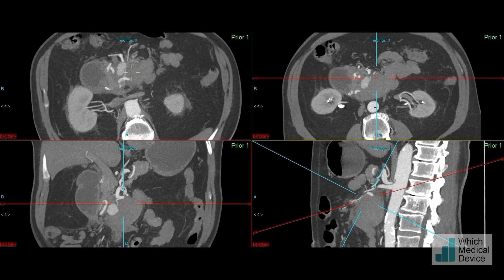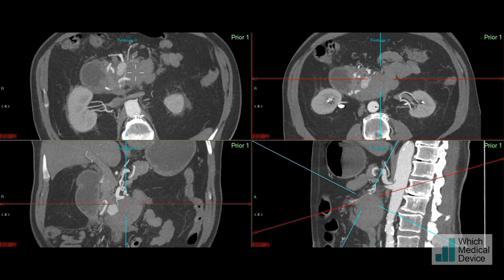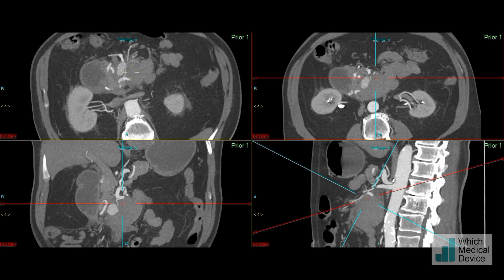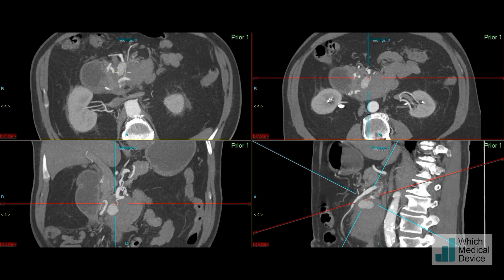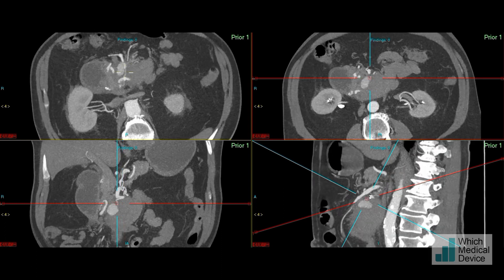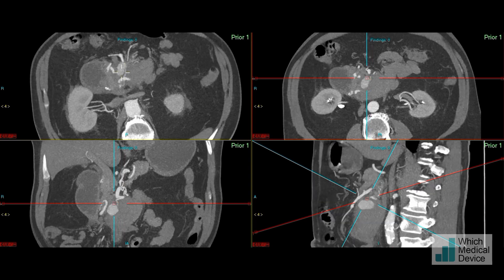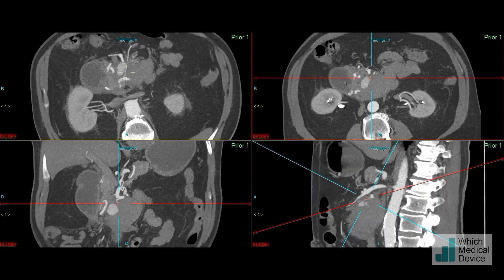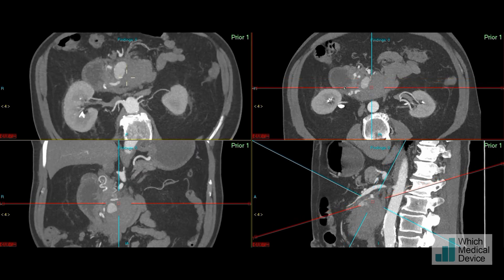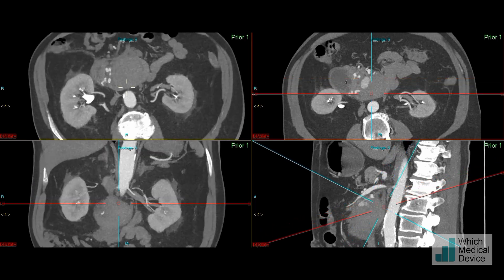I'll just take you through how we went about doing that. This is the presenting CT scan, and if we look at the sagittal view and scroll from side to side, you can see the very obvious median arcuate ligament compression with the virtually occluded celiac axis. As we come across, you can see the pseudoaneurysm here, arising from this tiny little branch from the inferior pancreaticoduodenal artery.